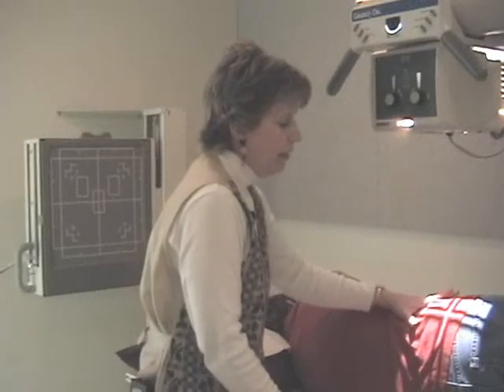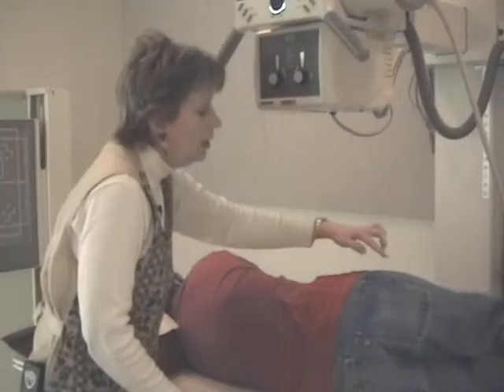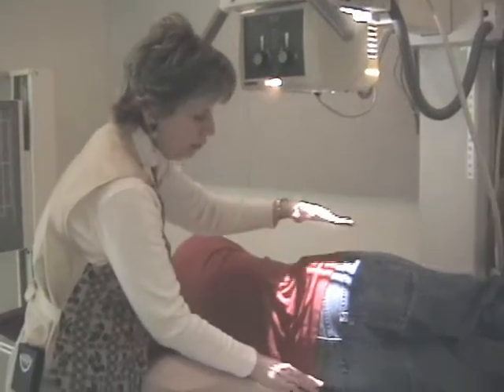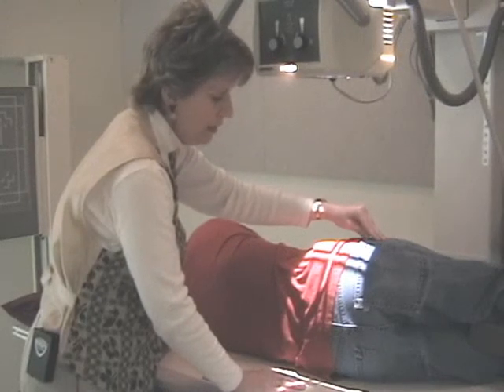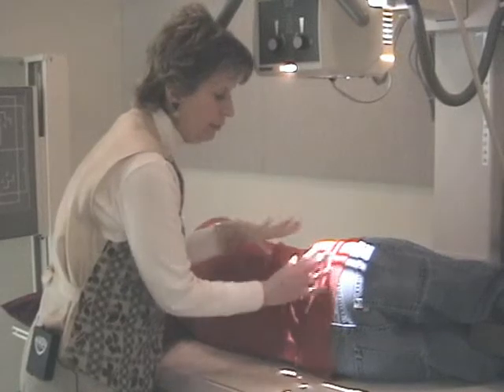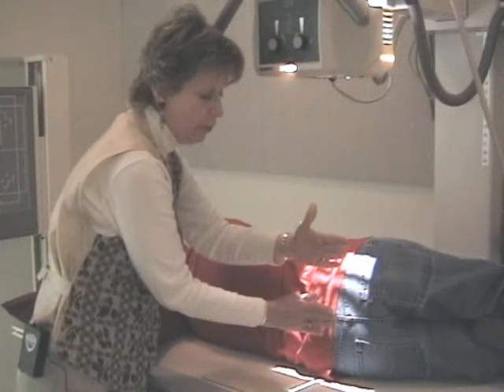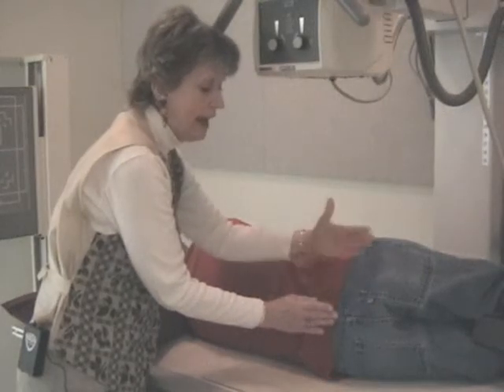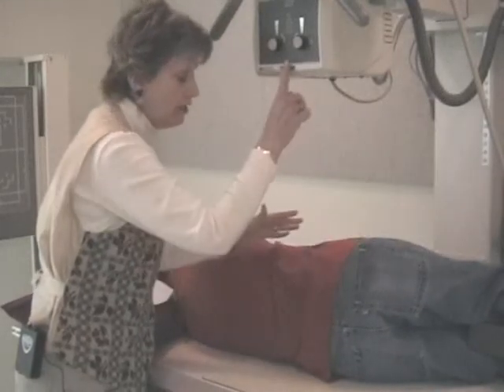If you've shot this x-ray and the patient's in a true lateral position, the acetabulums, this one and that one, will be on top of one another. This one, of course, will be bigger because you have OID, but they should be in the same vertical plane. If the patient is not lateral, like that, the acetabulum, instead of being one on top of another, one is shifted forward and one is back. Okay? You don't want anterior and posterior displacement of the acetabulum. They need to be one right on top of another.